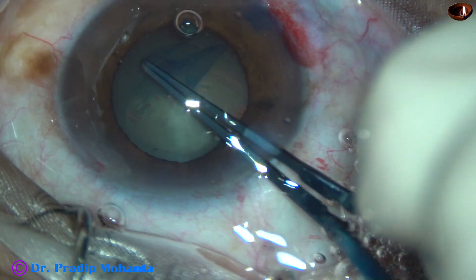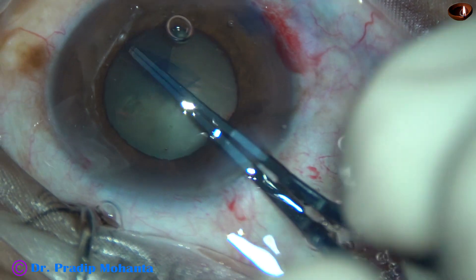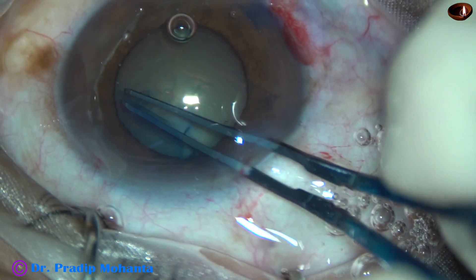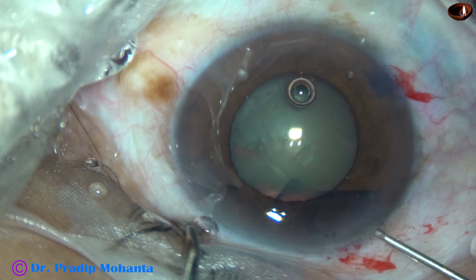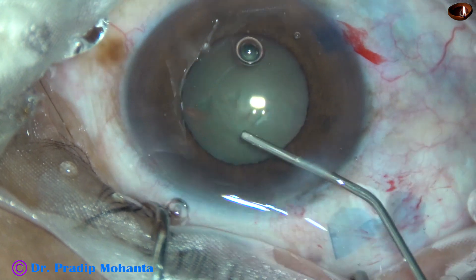After the initial steps, capsulorhexis is being done at this moment. The patient is under topical anesthesia and was not very cooperative. However, we could manage the case.